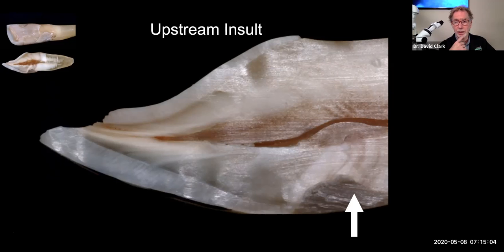Can everyone see what's going on? This restorative intervention is now stimulating artificial dentin deposition or reparative dentin deposition that we think is probably going to be choking the pulp off later. So this is one more reason to think about maybe stimulating artificially to get the reparative dentin is haphazard dentin. Every endodontist will tell you that this sort of thing leads to really weird dentin deposition. It's haphazard dentin deposition sometimes. And this was not even a direct pulp exposure. Imagine if that was a direct exposure, you'd have this thing choking itself off a little sooner.